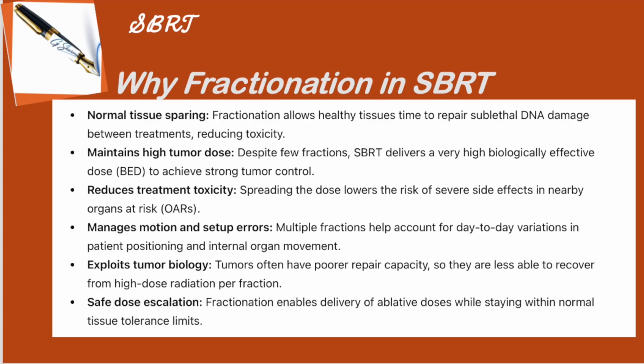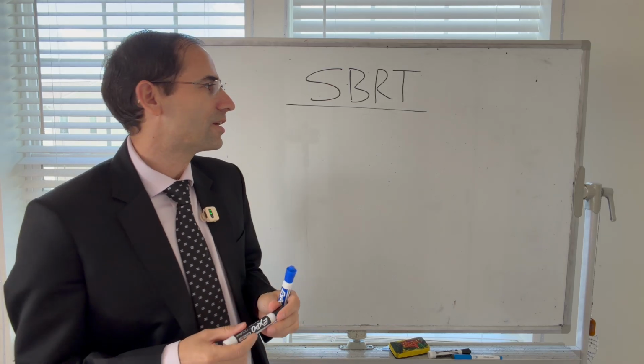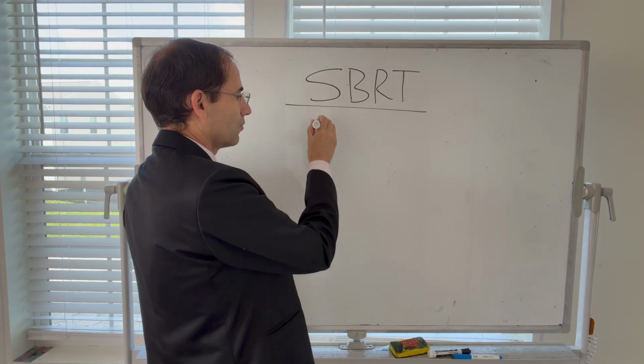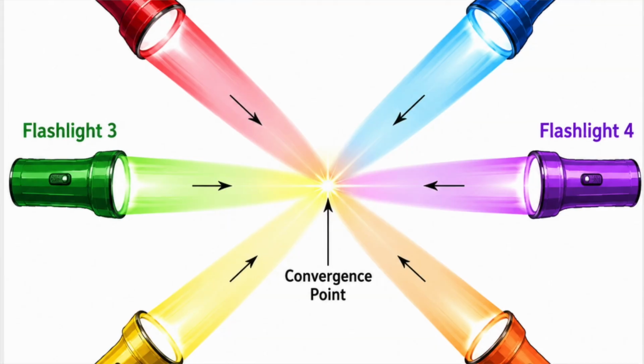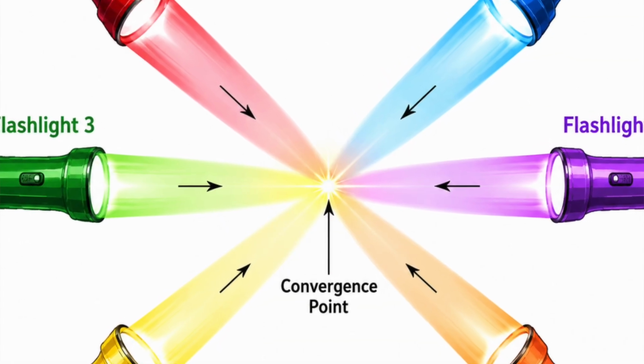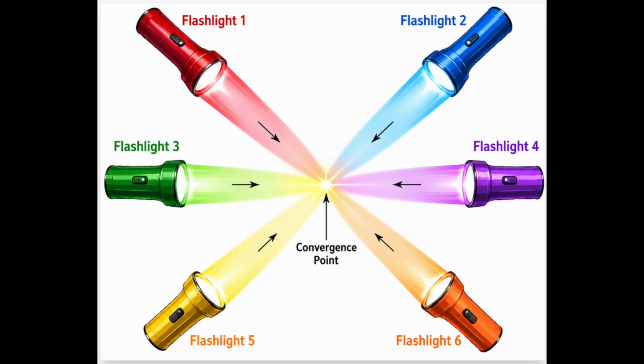That brings us to one of the most beautiful aspects of SBRT, which we call dose conformity. Remember this term, dose conformity. Imagine shining multiple flashlights from different directions onto a single point.